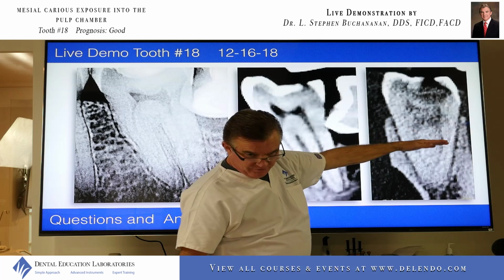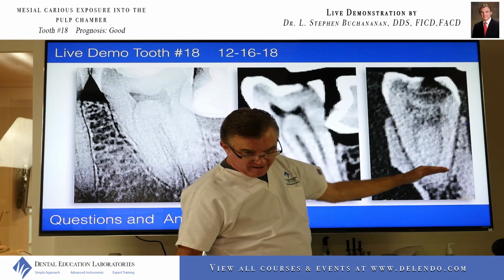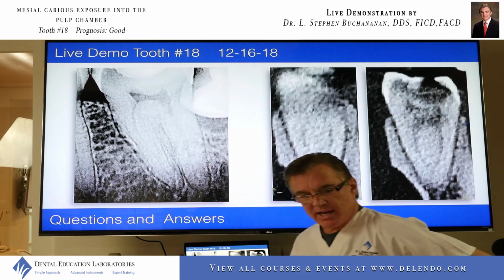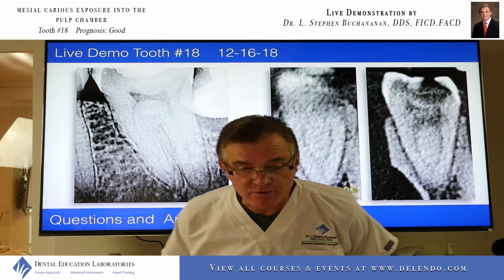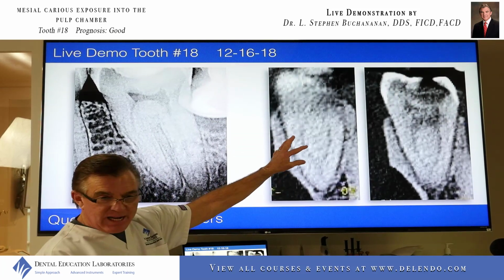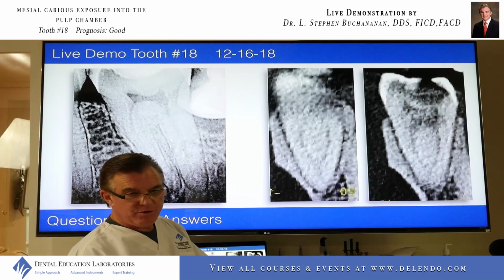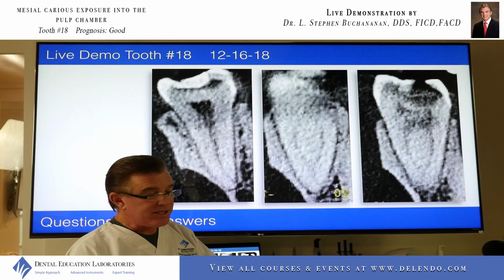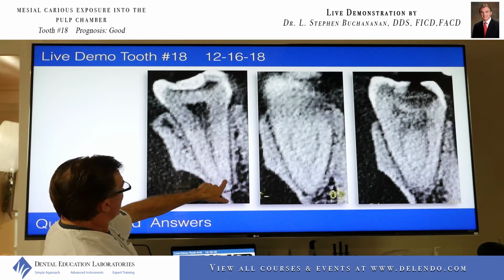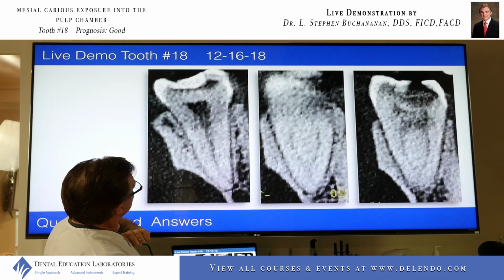Here's the mesial view of the mesial root, and we're only seeing the coronal half. Here's the apical half. So when you see them side by side, you'll know. You can see we have two canals that are confluent right about here, the apical third. The distal canal, single canal, relatively simple, exits on the side of the root here. It's got about a 25-30 degree curvature.